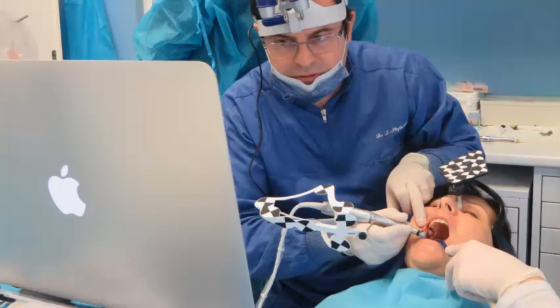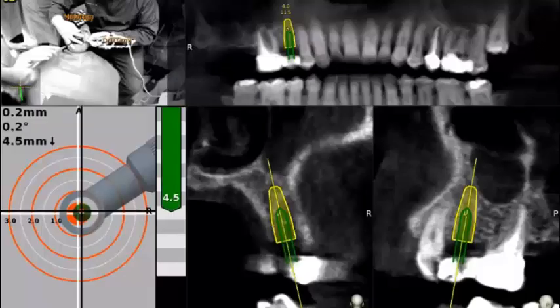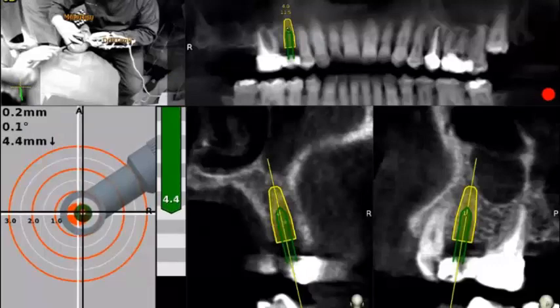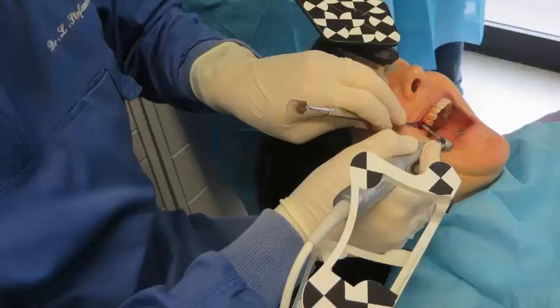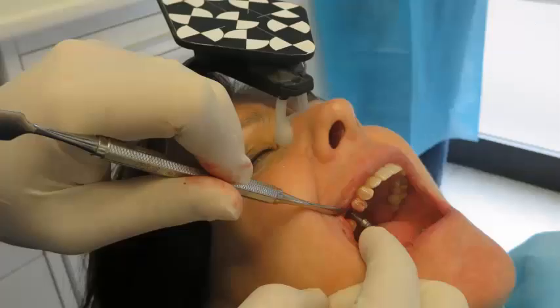That exercise is carried out looking at the laptop screen. And of course, not only in drilling but also in placing the implant, the whole exercise can be guided dynamically using Navident.